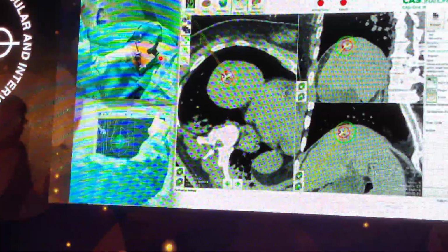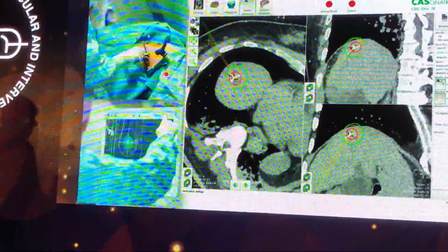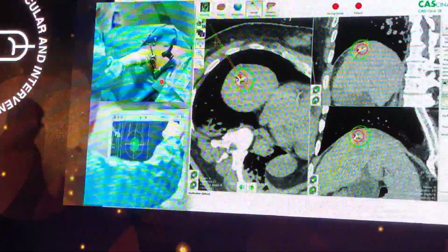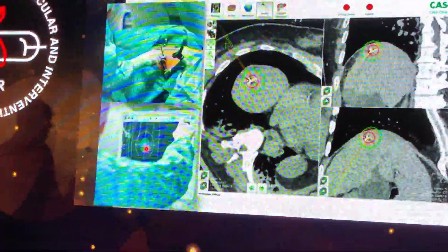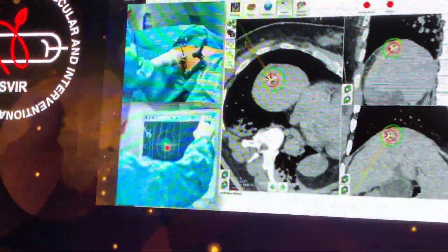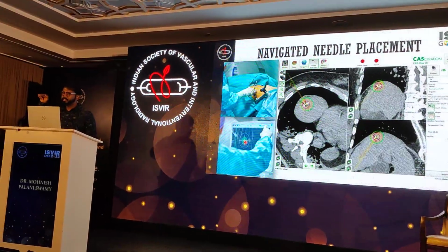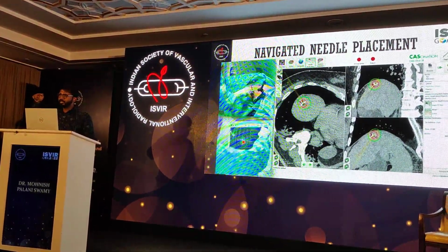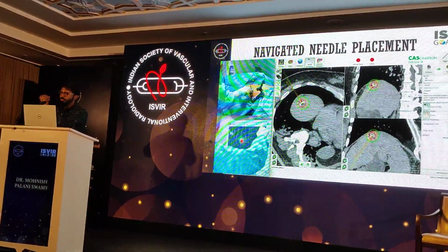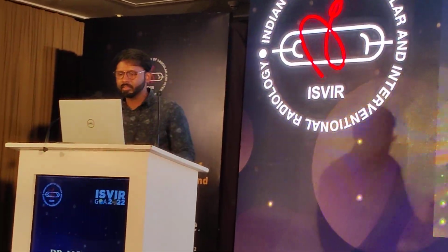So what we do is, there is a fixed arm which comes along with the table with the patient fixation device, which will let us target pinpoint. And there's a device which comes to help us target directly. For example, it's like holding a pen and you're just trying to move it around to see which is the area, and you use the robotic arm to fix that position, and then you remove this device and you put the ablation needle on.